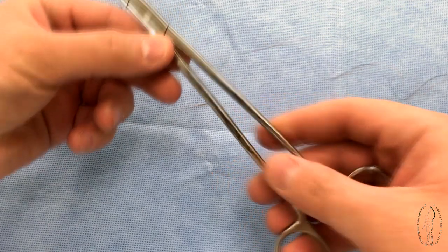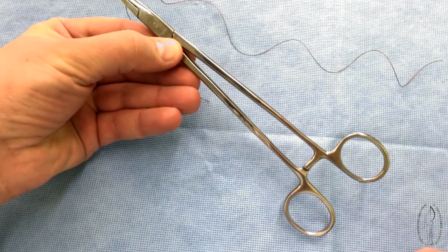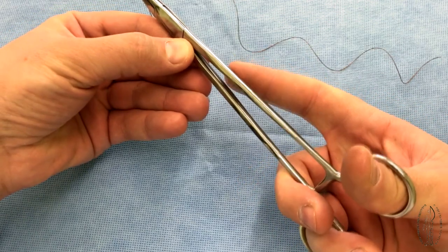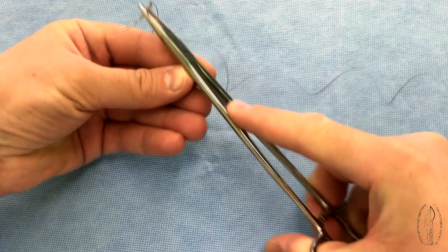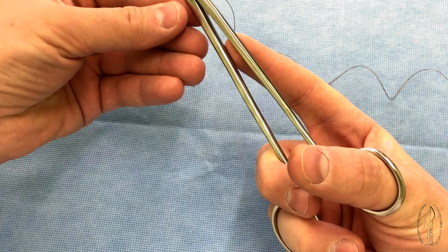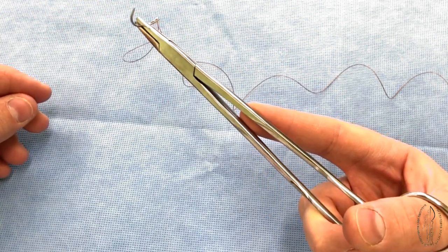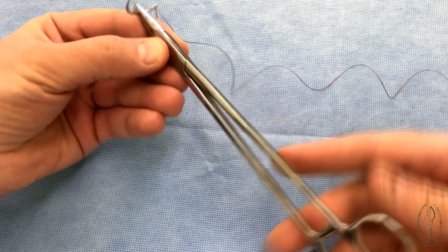The position of a needle holder in a surgeon's hand should be convenient for an operation. The thumb and fourth fingers are inserted into the tool ring. The index finger lies on its handles and plays the role of a lever.